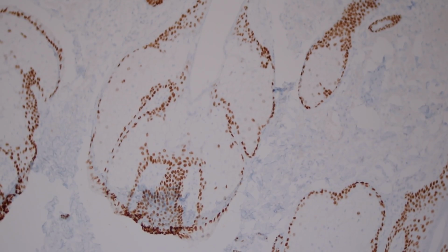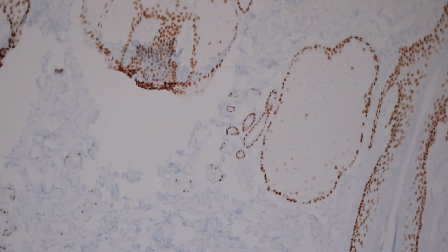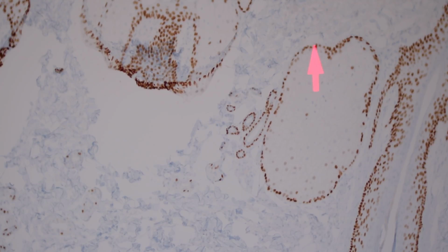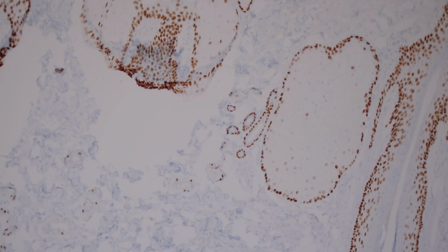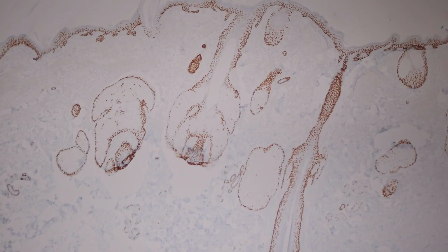And as you go down the follicle, you can see the sebaceous glands kind of coming off of the follicle here. And it nicely stains the basal layer, the germinative layer of the sebaceous gland. But you can see that it only to a lesser extent stains the mature sebocytes. They're either weakly positive or negative. But the basal layer is actually nicely positive.